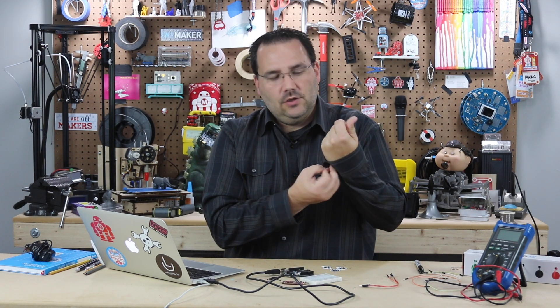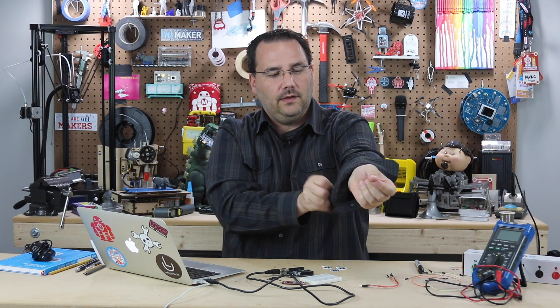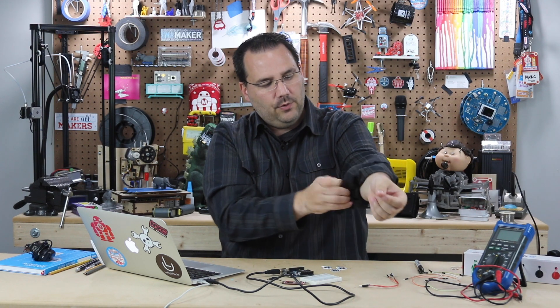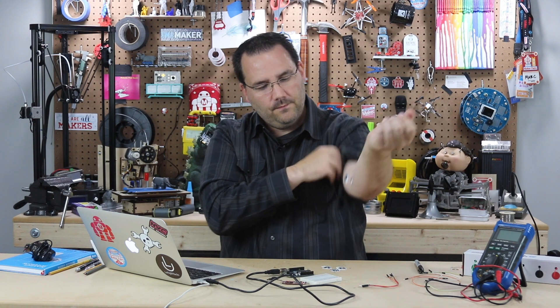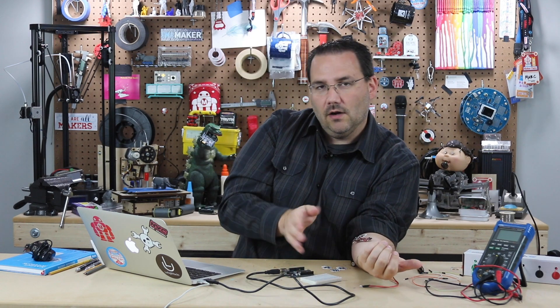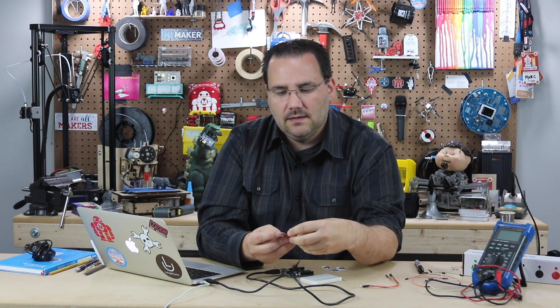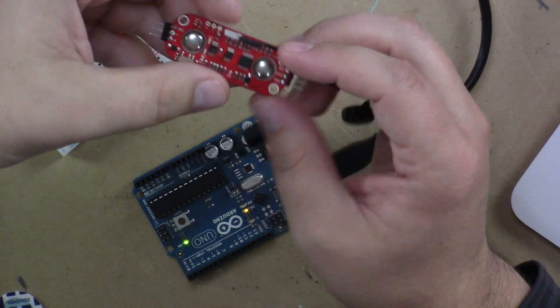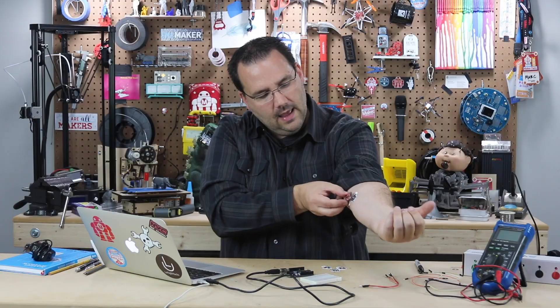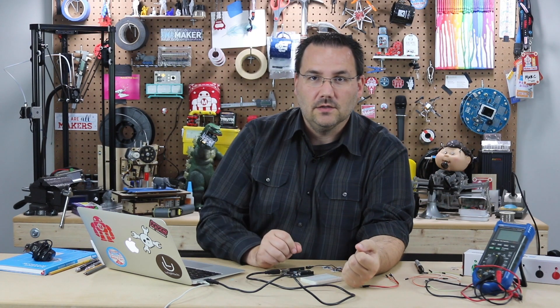You should read the data sheet and really understand how this works, because placement is absolutely critical. What I like to do is take the sensor and put it on my arm, and without really touching it, run a few tests until I find the perfect spot. I happen to find that there's a muscle right here, and the mid-muscle sensor sits perfectly on my arm in this location, and the ground over here can sit right here on my arm. I've been getting really good results.